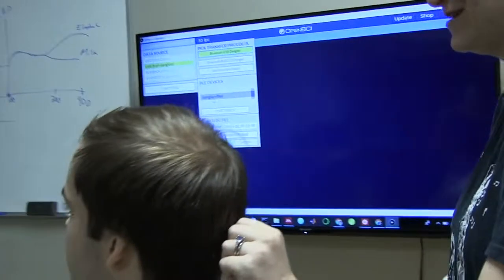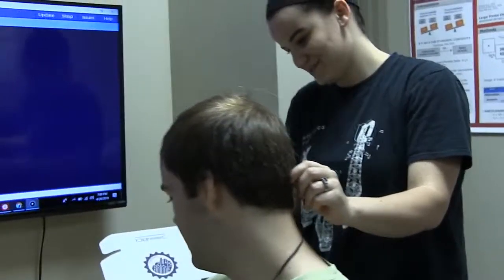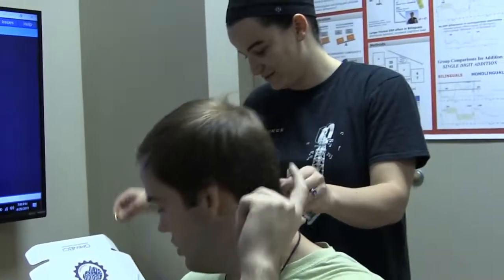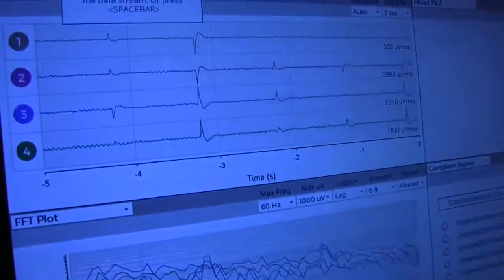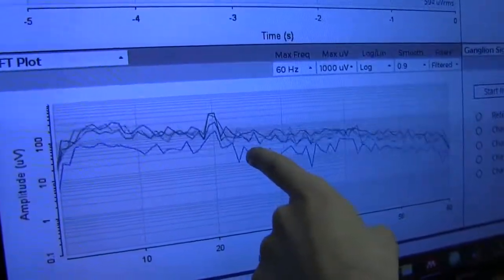One of the main priorities using this device for children is ensuring that the electrodes are comfortable and that there's no discomfort while placing them or adjusting them for a better reading. There are also many adjustments to the algorithms that make sense of the data, which would make the game either easier or more complex.